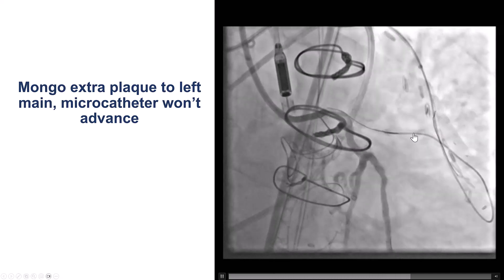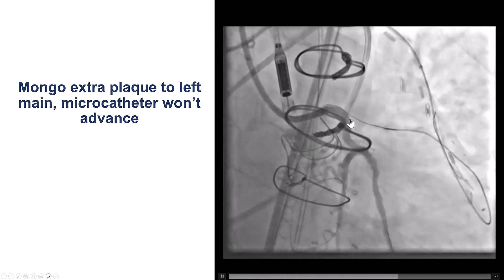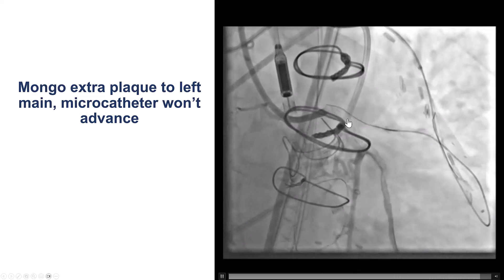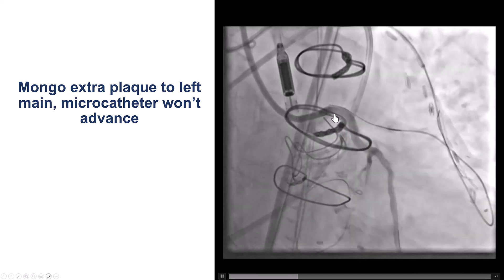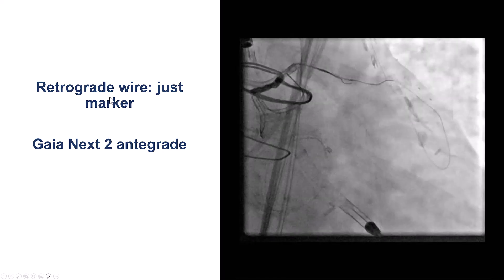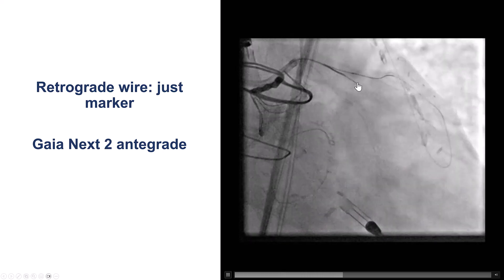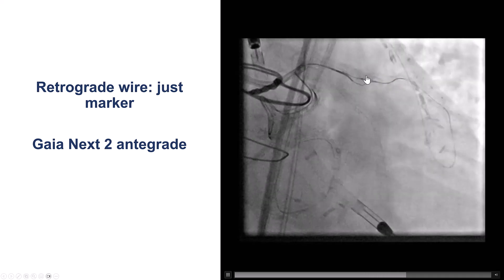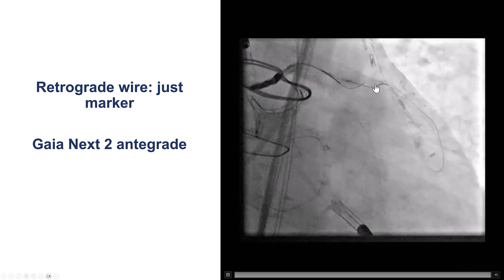The problem was that the retrograde microcatheter would not advance any further because of severe calcification. So what to do next? One option was to use the retrograde wire as a marker for advancing an antegrade wire. This is what we did — we used a Gaia NX2, now that we knew where to go, and tried to wire next to the retrograde guide wire, which was challenging.